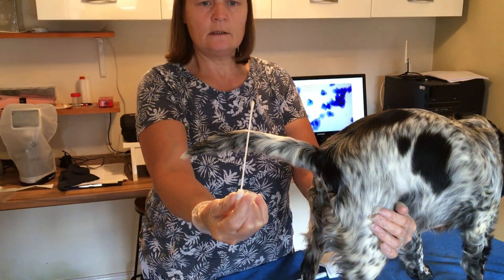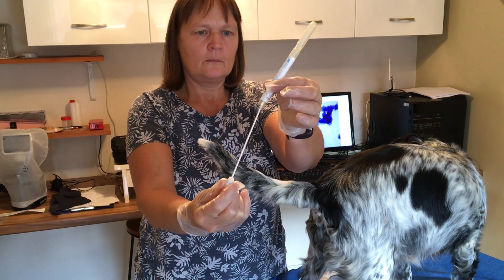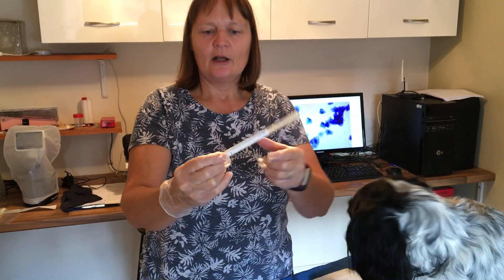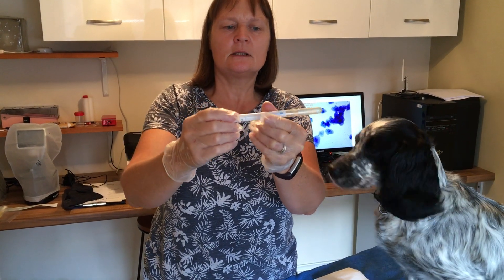That's your swab all ready to send to me. Just pop it back, put the cap on, pop it back in its holder. Possibly a little bit of tape around there just to make sure it doesn't dislodge in the post, and then send it back to us in the envelope.